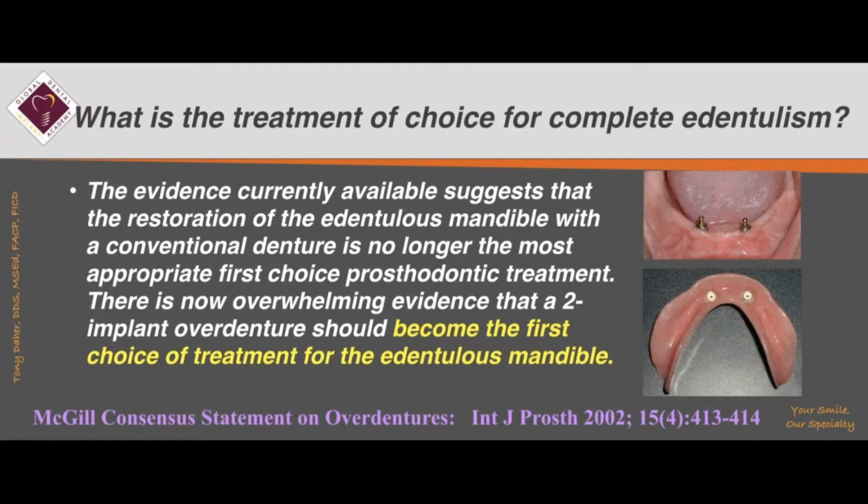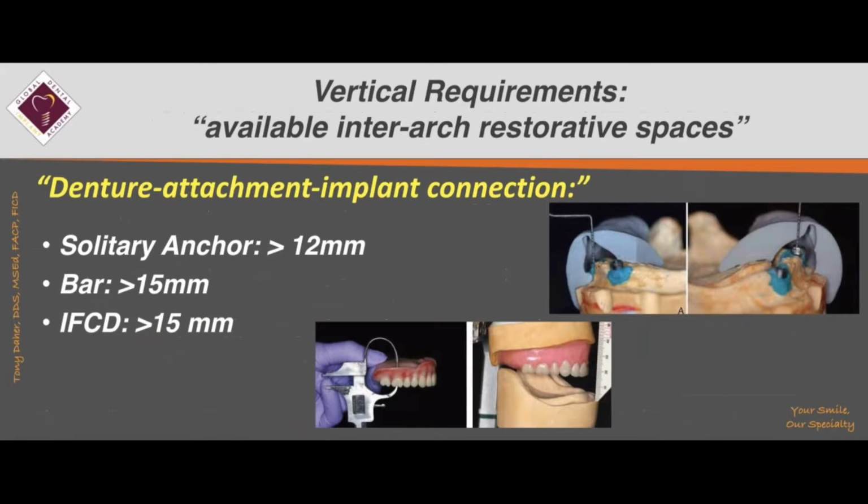And then afterwards, depending on whether the patient has money, or has not enough, or has the time to do all this, now you can degrade the treatment to implant, to 3-implant, and so on and so on. So the first choice for me is a bridge, not a 2-implant mandibular overdenture. So I don't like that statement. And now we're looking at it very closely.